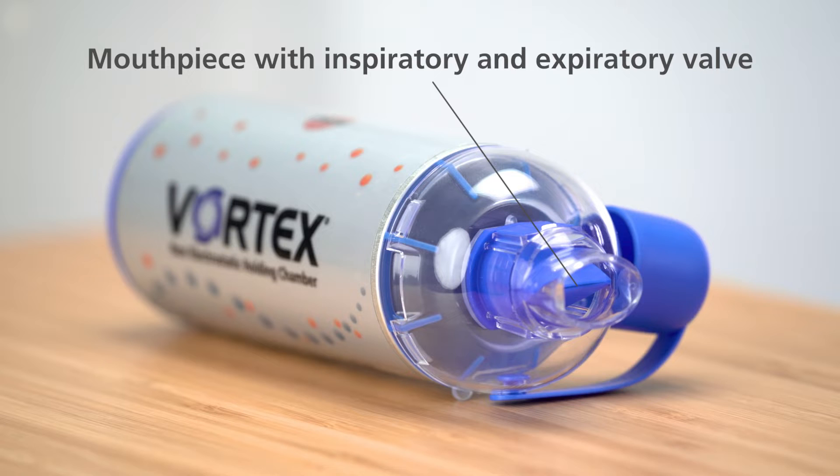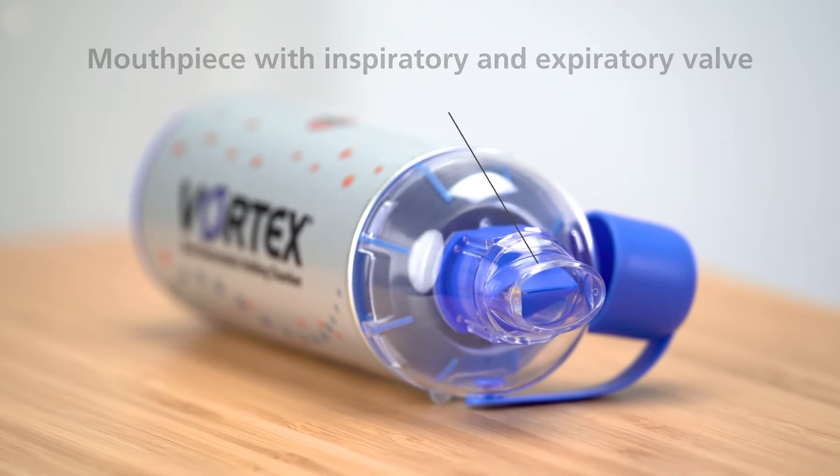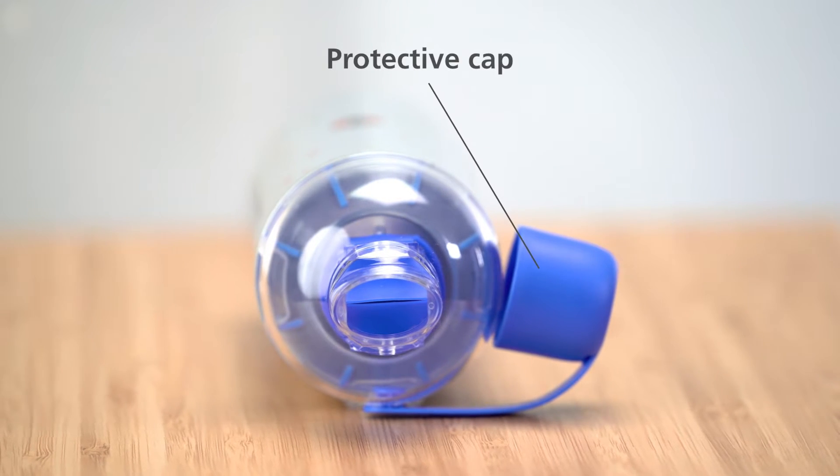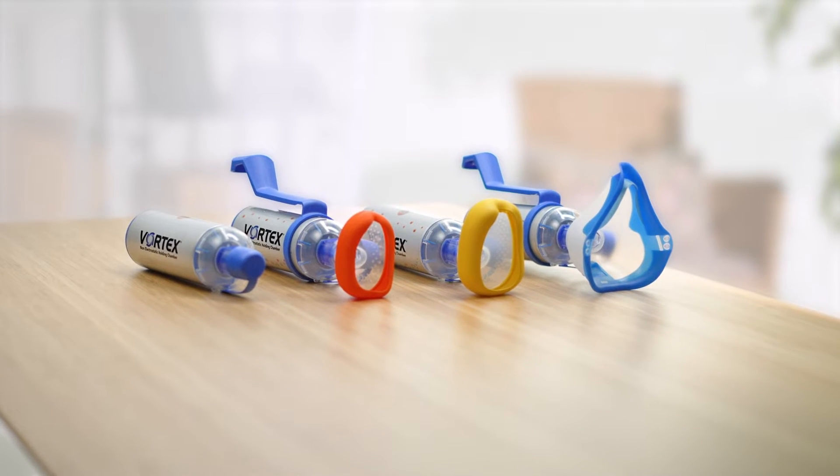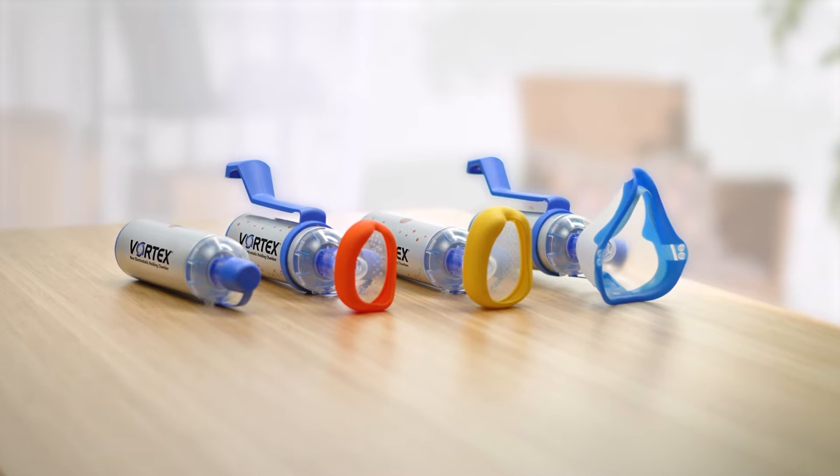The removable mouthpiece features an inspiratory and expiratory valve and can be covered with a protective cap. To meet the needs of different age groups, there's a range of accessories available for the Vortex.